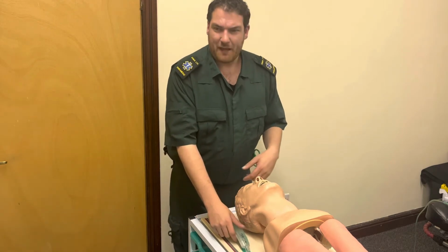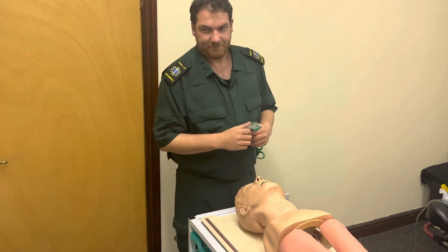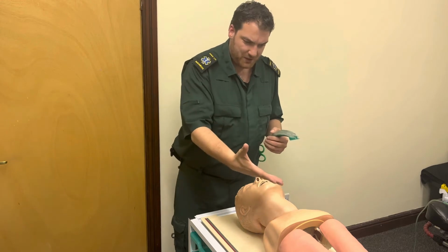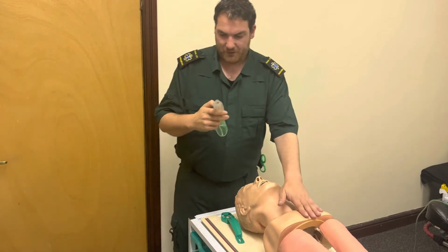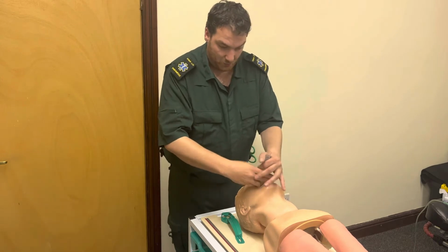So basically, imagine now someone's doing compressions. All right? While they're doing compressions, I'm going to tell them, keep doing compressions, because they're going to move whatever oxygen's in the body already. And we're going to use this i-gel. I'm going to base this person around 50 to 90 kilograms. All right? So I pull it in, I'm inserting it while they're doing that.